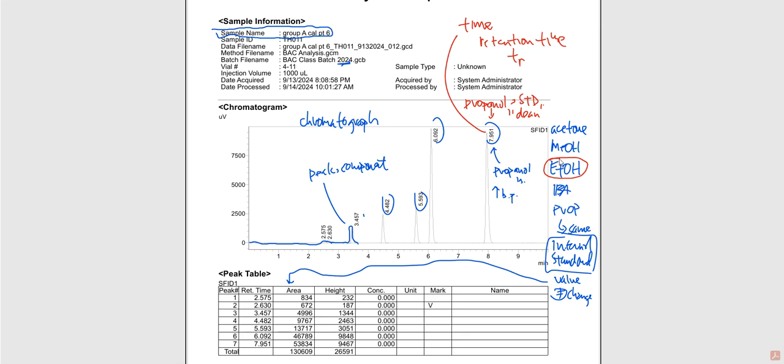Hey, ethanol. All right, so ethanol is going to be a component. That component is going to be injected into the GC system. We saw that. Ethanol is going to take its time and it's going to go through the tunnel, aka column, and it's going to go out the other end to the detector. So we get ethanol that finally arrives. Yay!